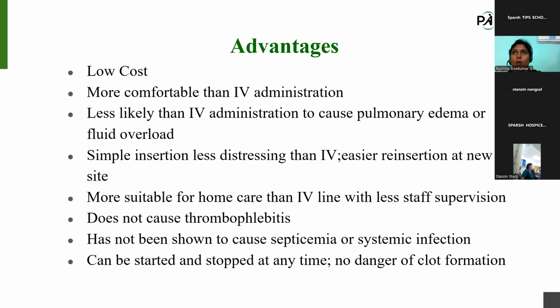And it does not cause thrombophlebitis, because we are not inserting anything intravenously. So there is no chance of formation of thrombophlebitis. It also does not cause septicemia or systemic infections. We are not inserting anything intravenously, so the chance is very low. And it can be started and stopped at any time, with no danger of clot formation.